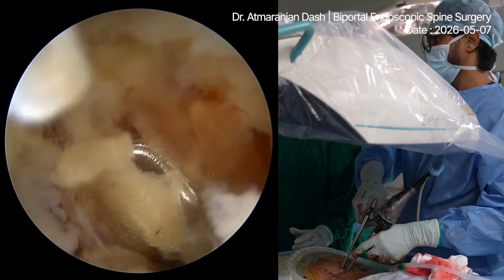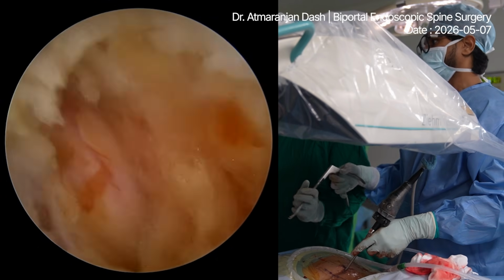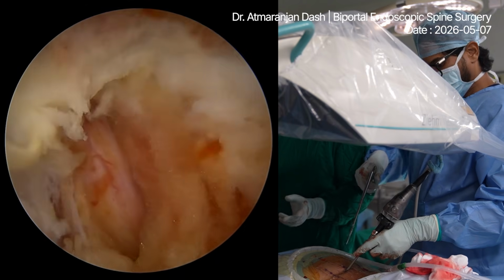I will summarize my surgery at the end of this foraminotomy. It is a fast, effective technique. Now you see the root very beautifully.